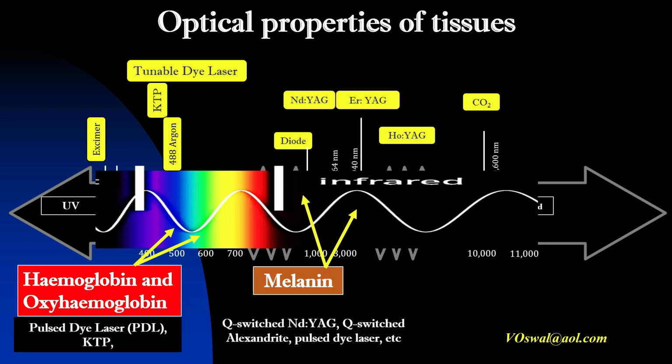For tissues that are rich in water, like those encountered in my specialty of ENT, the mid-infrared laser, such as the CO2 laser, is a preferred option. Hence, we acquired the first CO2 laser of its kind in the UK, featuring an articulated delivery arm that connected to the operating microscope.